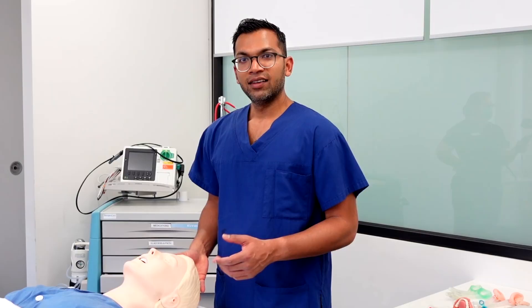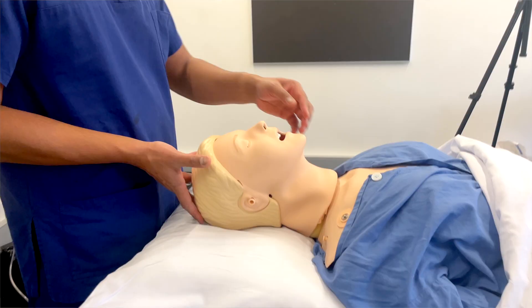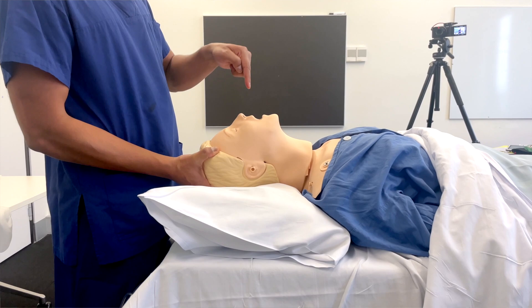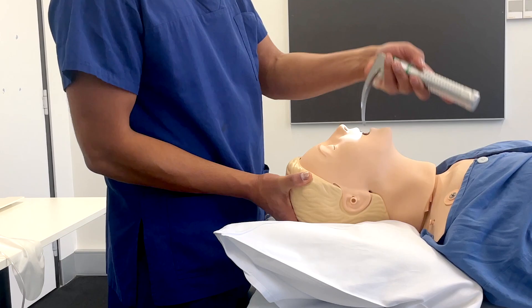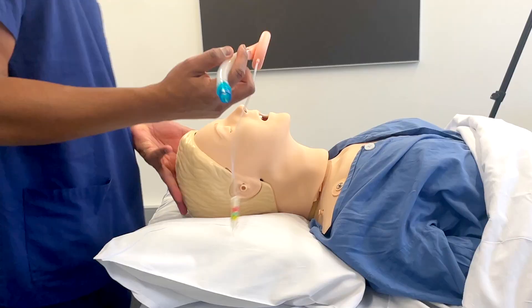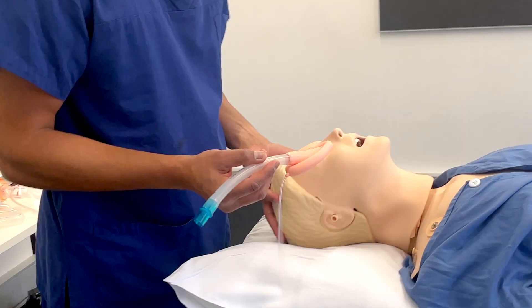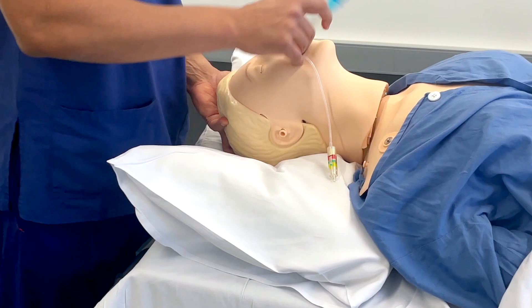The head tilt is a really useful technique — I also use it when inserting an LMA and during laryngoscopy. It tries to line up the three axes by tilting the atlanto-occipital joint, aligning the oral axis with the pharyngeal and tracheal axis. I simply move the head back and also open the mouth, which allows me to guide a laryngoscope in more easily. Using my left hand for head tilt frees my right hand for LMA insertion — it reduces the sharp angle and allows the LMA to fall in easier.